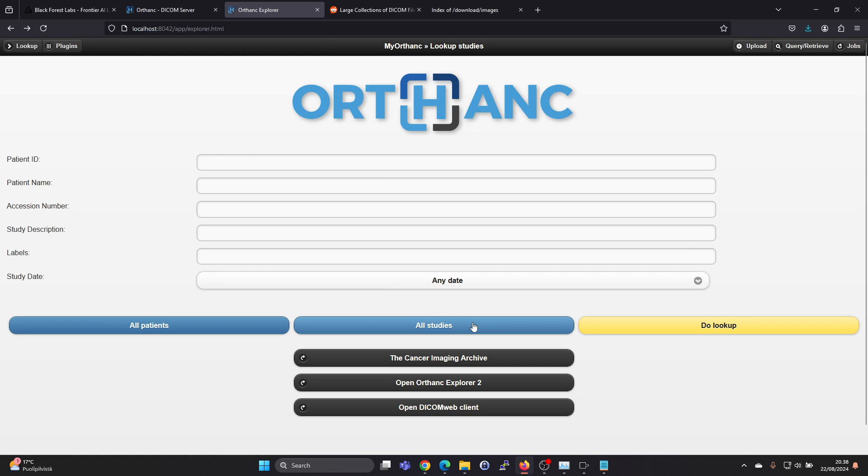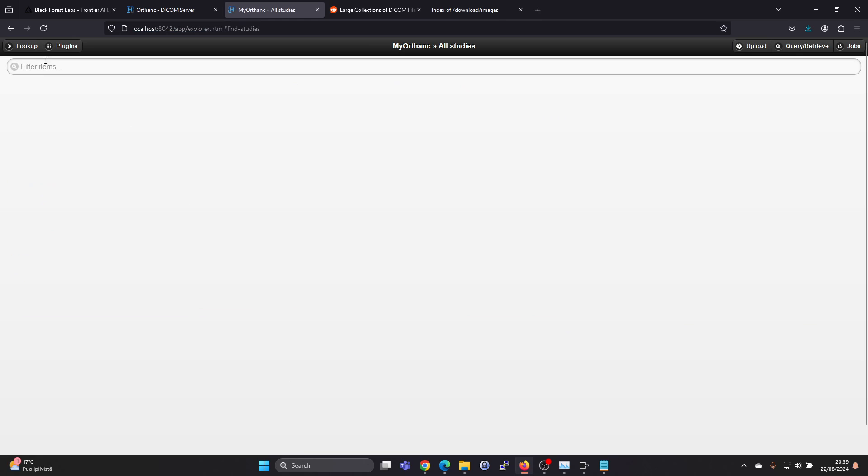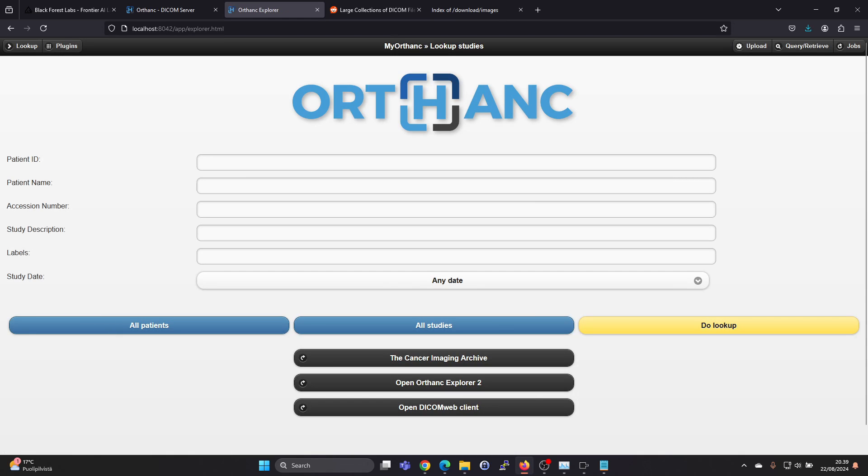But if you click on all studies, there won't be any studies to start with. So you need to import or upload some studies to see something in it.